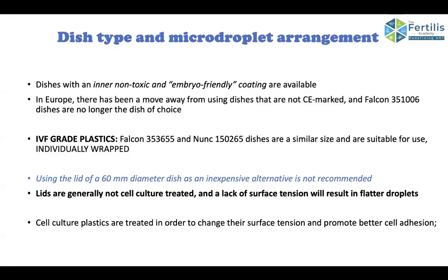I've seen people working in the lids of 35 dishes or 60 dishes as an inexpensive alternative, but please don't use the lids for any culture. Lids are not generally cell culture treated, and there is no coating on the lids. Lids are simple plastic material.